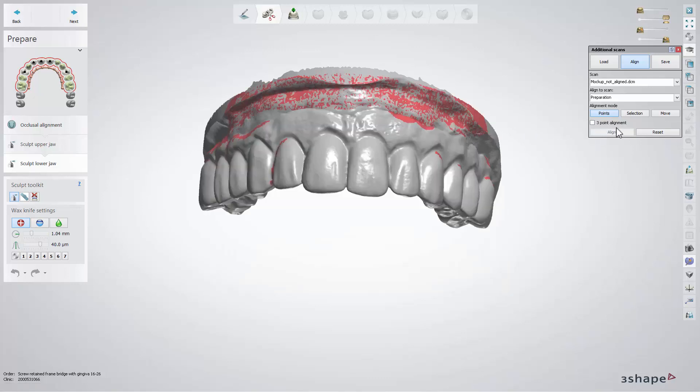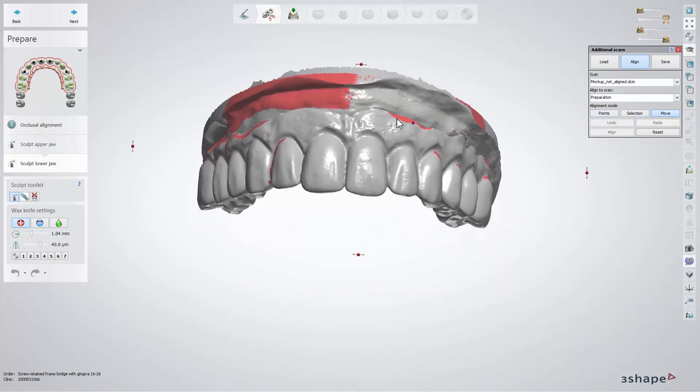The Move feature lets you move the scan in a chosen direction, and you can use the Undo and Redo buttons.